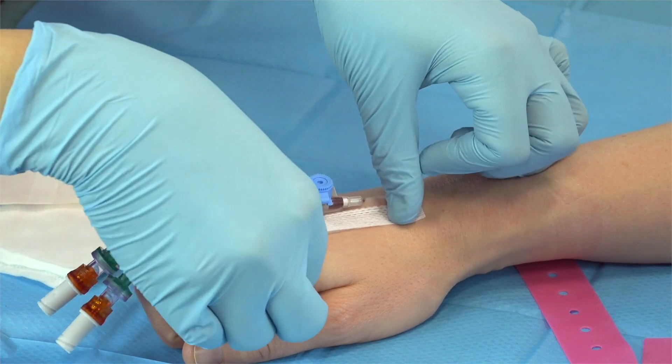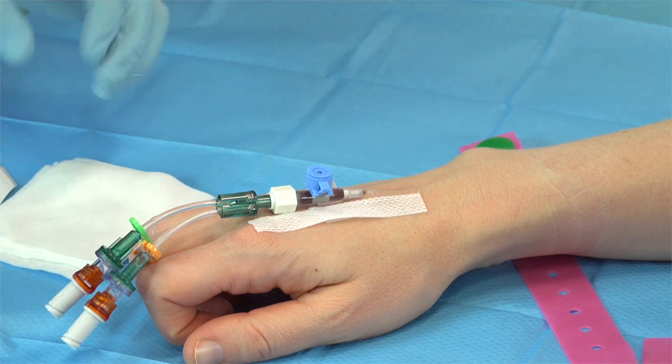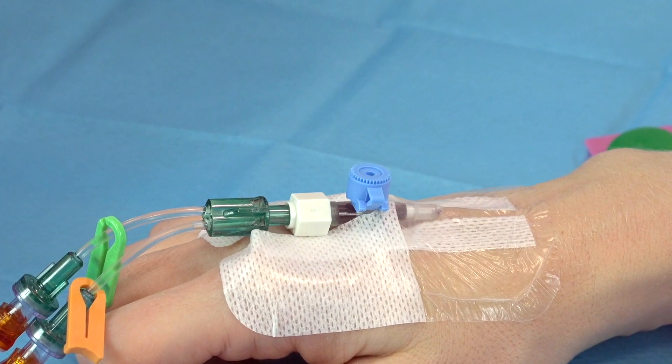After the cannula has been inserted, the wings and the hub rest upon the surface of the skin. And after being secured with adhesive dressings, they provide a means of accessing the cannula.